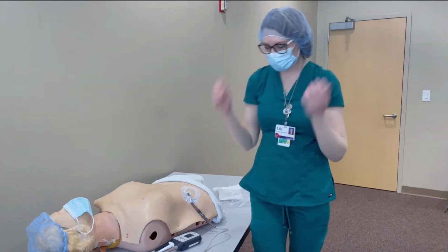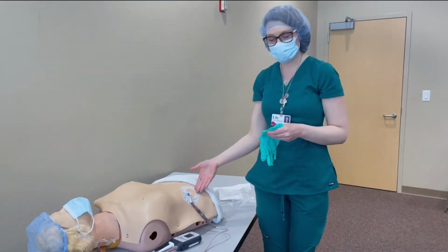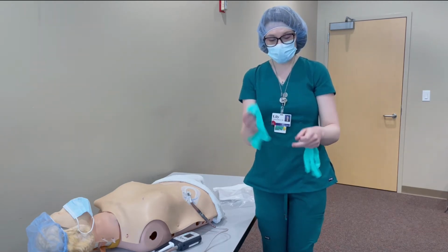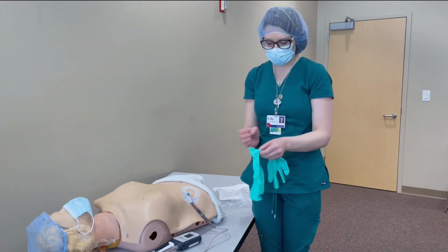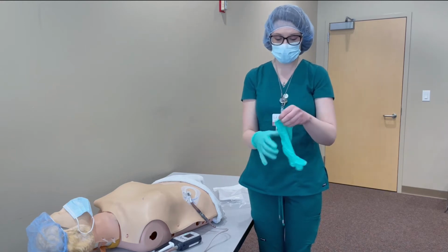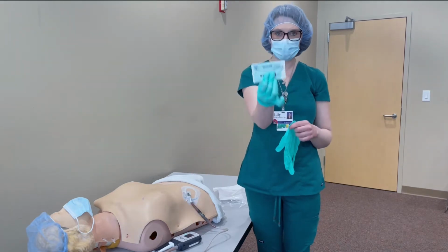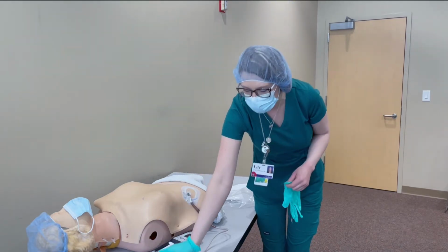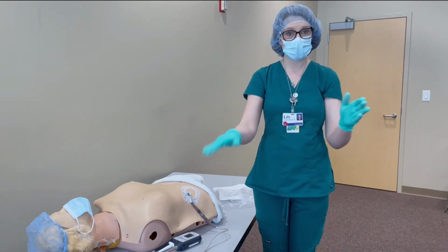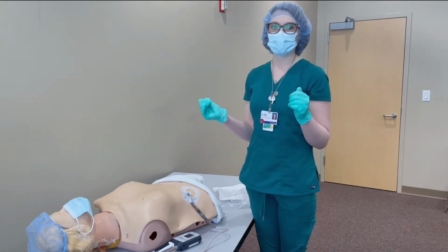Okay, so now we'll go ahead and apply our clean gloves, and that's gonna be the gloves we wear to remove the old dressing. The difference between a clean glove and a sterile glove is that clean gloves are clean, they're not filled with germs and dirt, but they're also not completely sterile where they have zero bacteria like these gloves inside of this package. So we use our clean gloves to remove the old dressing. We're going to use sterile gloves to apply the new dressing. So now I'll go ahead and show you how we're going to remove the old dressing.